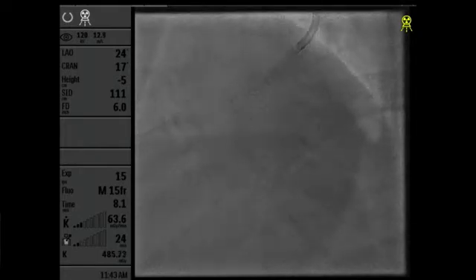So what are you doing? Let's see now. I'm going to try to see what the IVL is. I have the guide extension all the way down, and now I'm going to try to bring the same 3.5 by 12 IVL balloon to the distal edge of that stent. Okay, it should go. That's good. Let's see it. Just one more step in terms of time.